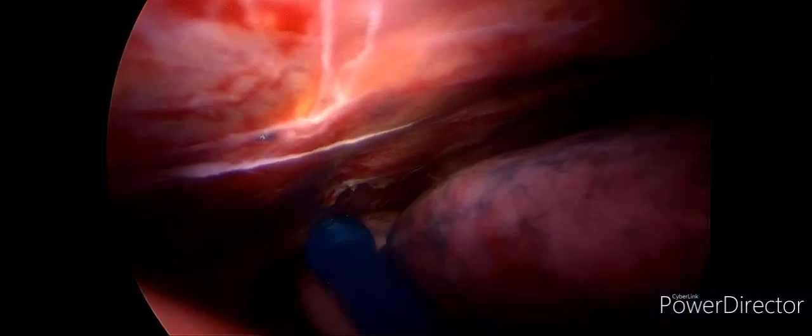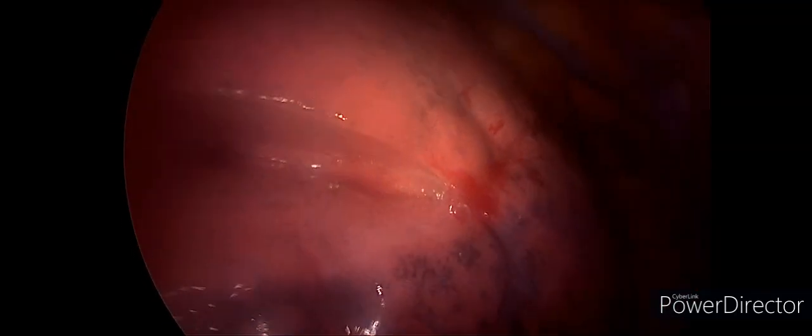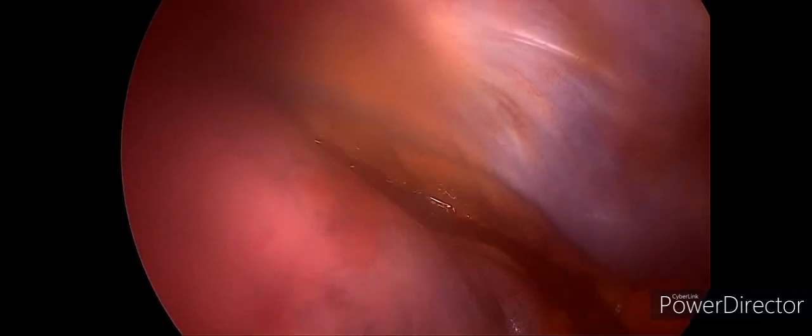As you can see, the whole upper lobe inflated completely, filling the whole space. Of course, at the end, a chest tube was inserted. The patient actually did very well with the uniportal incision. Pain was controlled, and he was discharged on day 3 after surgery.